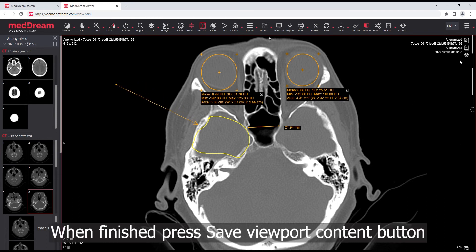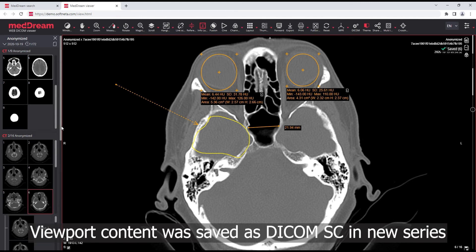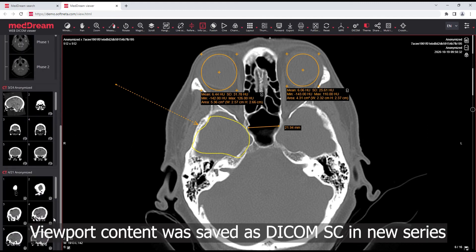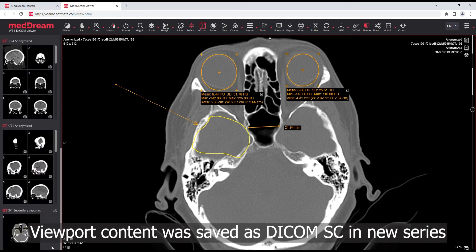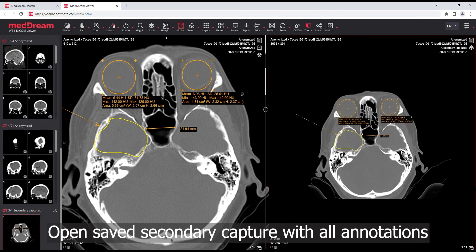When finished, press the Save Viewport Content button. The viewport content was saved as a DICOM Secondary Capture in a new series. Open the saved secondary capture with all annotations.